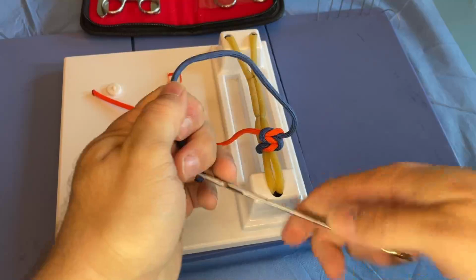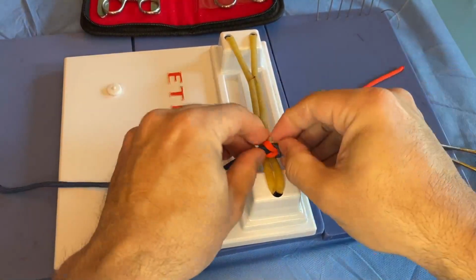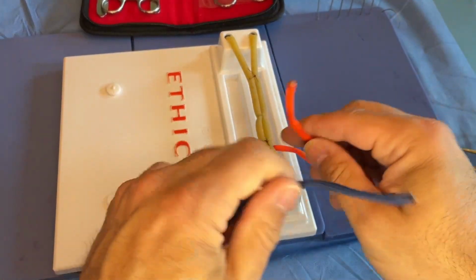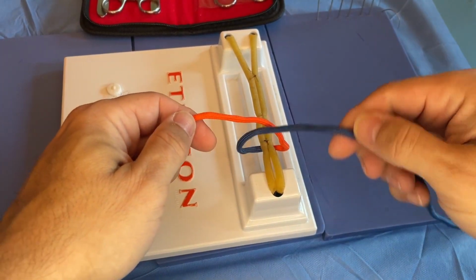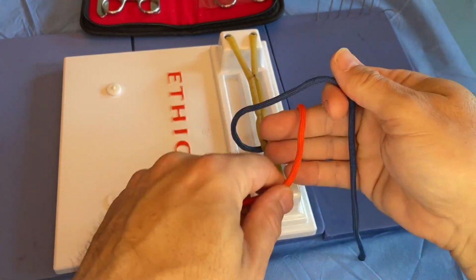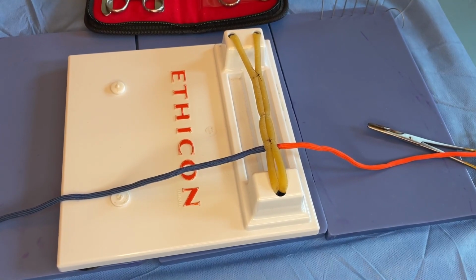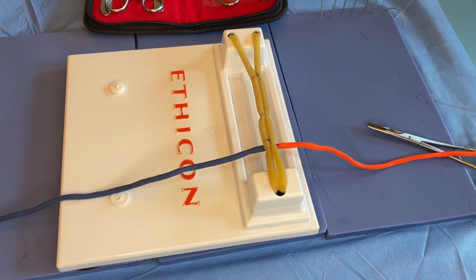And again, you can also practice this as if it was a free tie. Just have to quickly undo. So if you have a free tie, no needle, you can go ahead and cross the strands, and then you can do a similar sort of loop, and there you go. So that's a little bit of an overview of simple one-handed, two-handed knot tying.